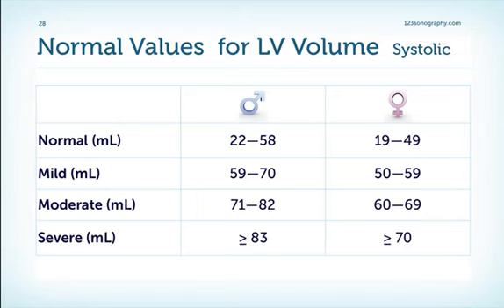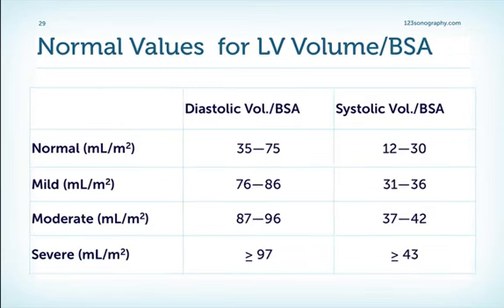Here are the end systolic volumes, and these are the volumes when we index them to the body surface area. I would prefer to use these measurements. Other measurements I'm showing here can also be found in your fact sheet.